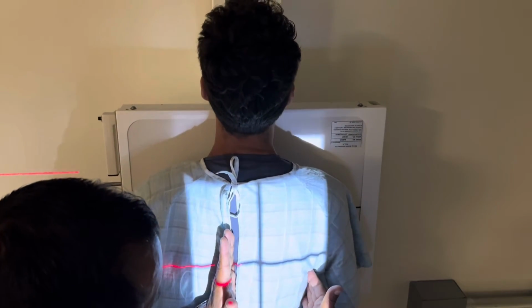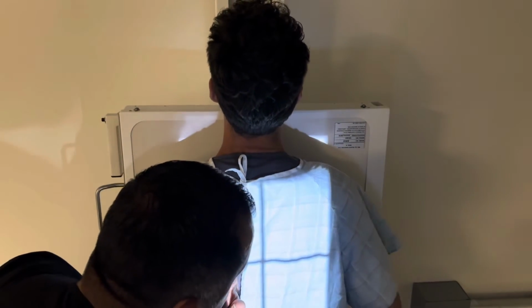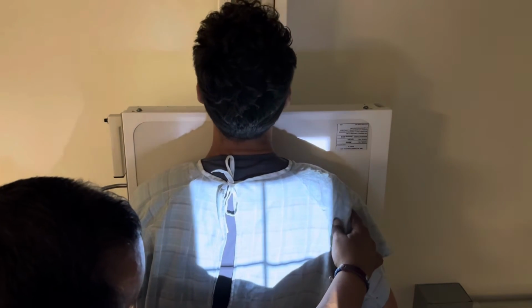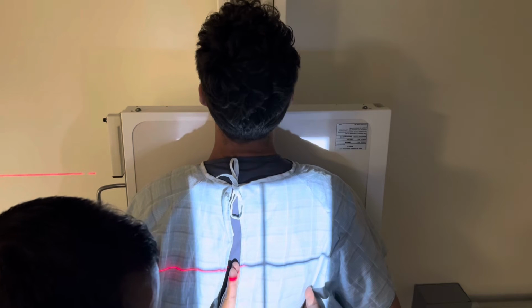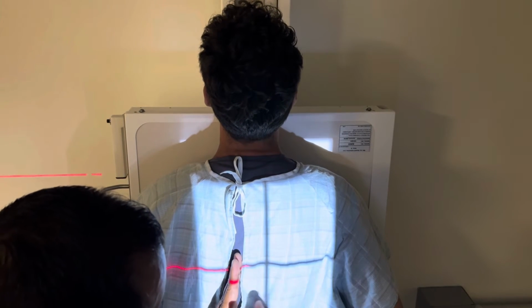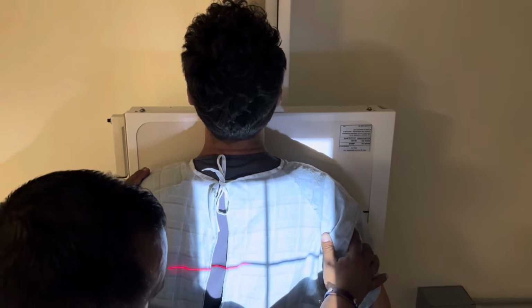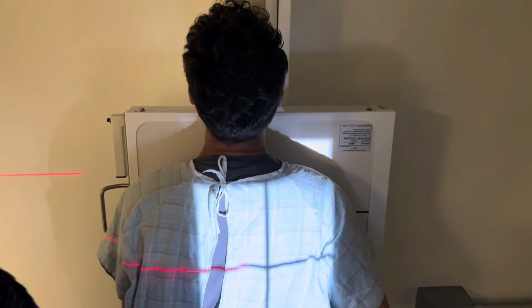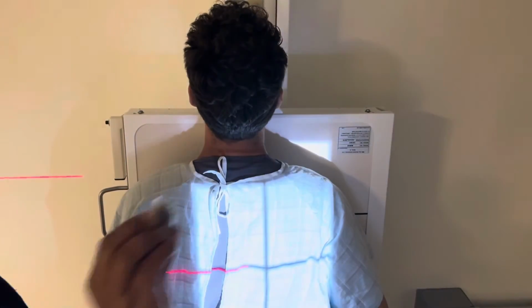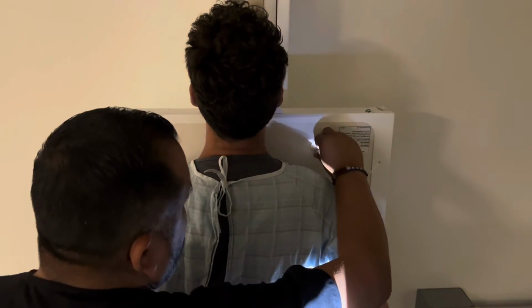Here's his axillary border. I'm going to abduct this arm just a little bit, just to get out of the way. All right, so I'm going to bring this over just like that. So again, here's his spine right here. Here's the axillary border. I want to try to get it in the middle. So I'm going to move him right there. There we go. Perfect. So now I'm going to flip my marker over. I have my right marker here. I'm going to put it down here just like this.